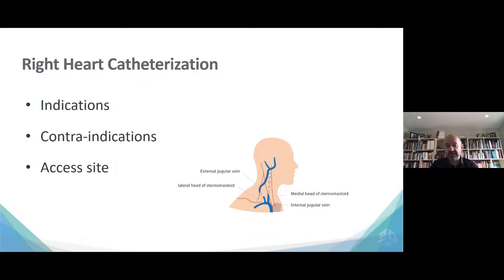As long as you have the volume, you may as well get cardiac output with the Swan-Ganz catheter, and it's a very, very big advantage. I have to say we used to do this a lot in the early days of Swan, and I don't want to date myself how long ago that was, but probably in the last millennium.